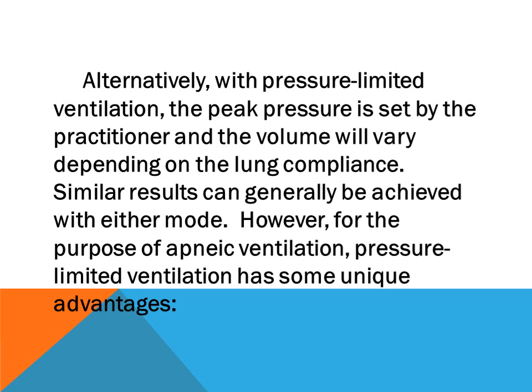In pressure limited ventilation, the peak pressure is set by the practitioner, and the volume will vary depending on the lung compliance. Ventilation can generally be achieved by either volume set or pressure set ventilation. For the purpose of apneic ventilation, pressure limited ventilation has some unique advantages.